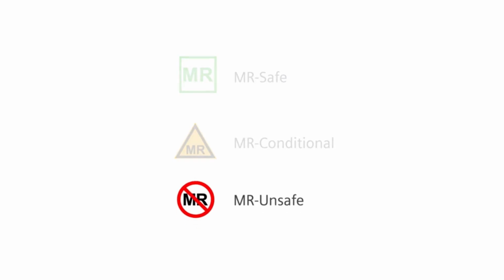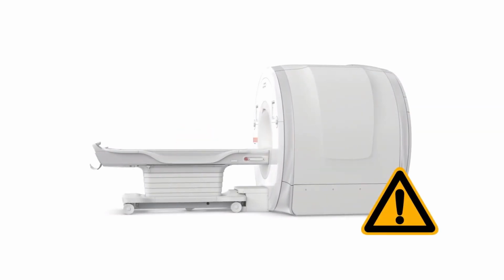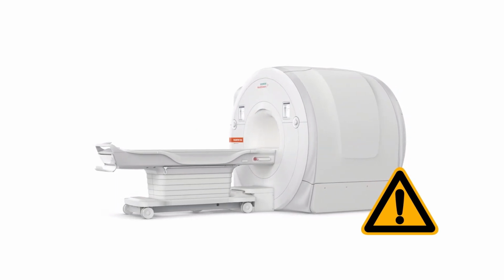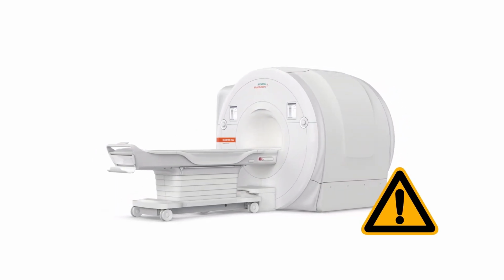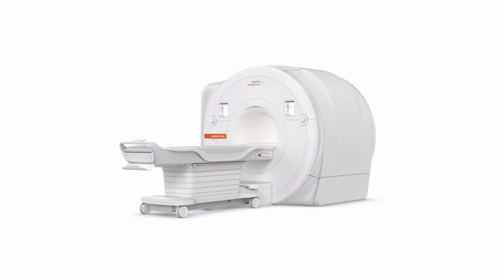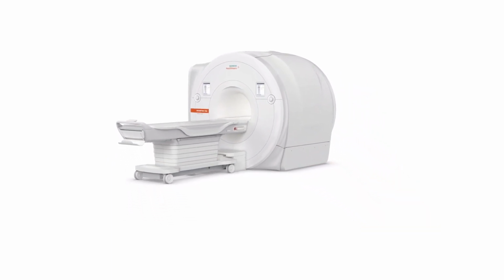MR unsafe objects are those which are known to pose hazards in all MR environments. MR unsafe items include magnetic items, such as a pair of ferromagnetic scissors. Attention! Only use equipment in the MR examination room which is labeled as MR safe or MR conditional. All non-labeled scanner items have to initially be treated as MR unsafe.